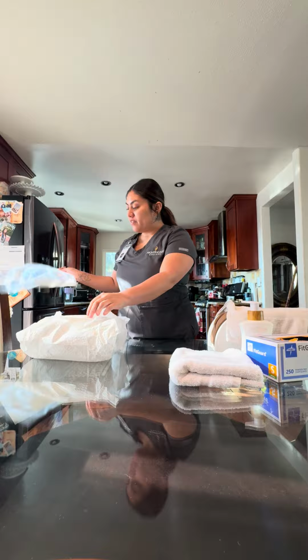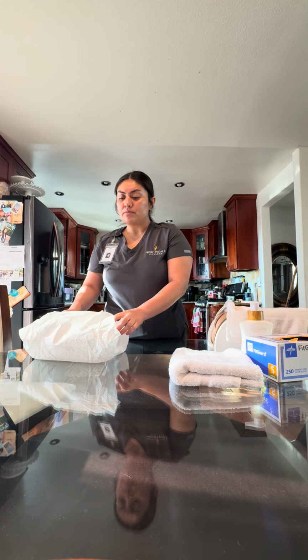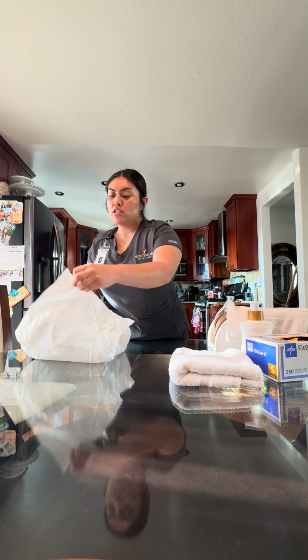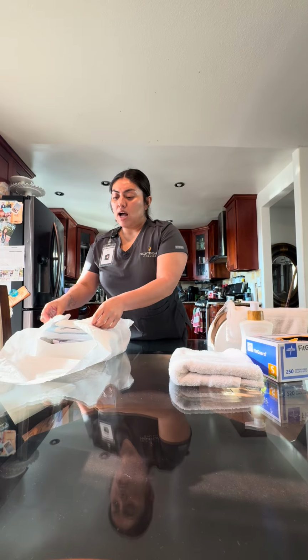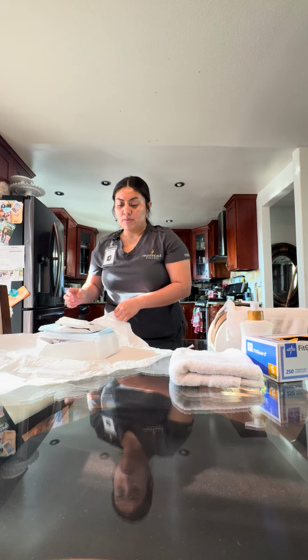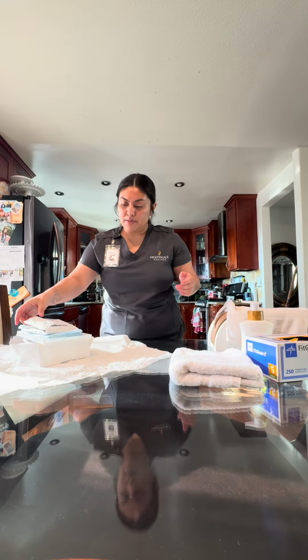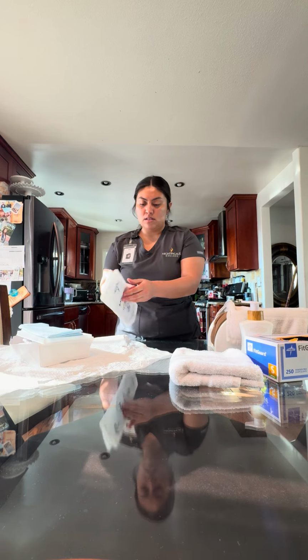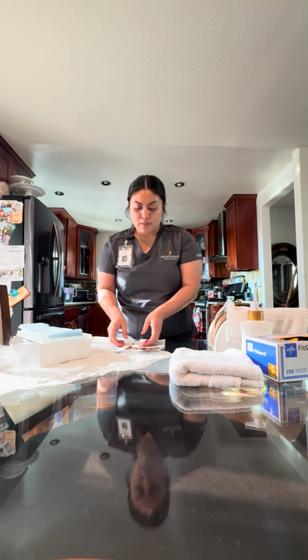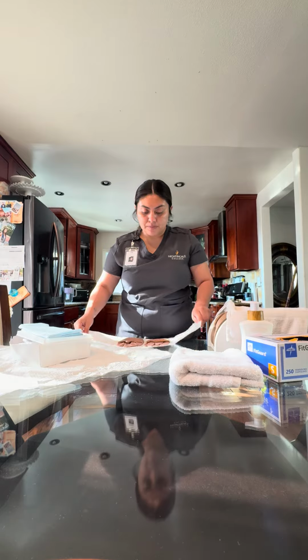I'm going to discard the packaging and open the kit with the fold furthest away from me, then the two sides, and down the middle. After that, I'm going to obtain my sterile gloves, making sure that I'm maintaining my 1-inch border.